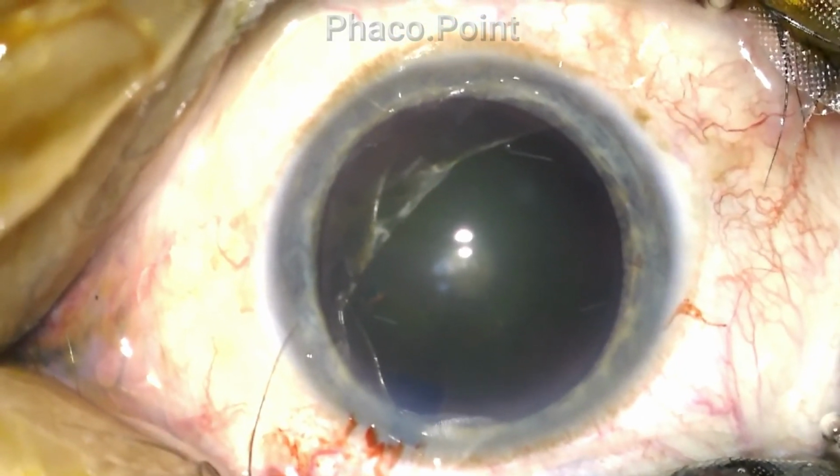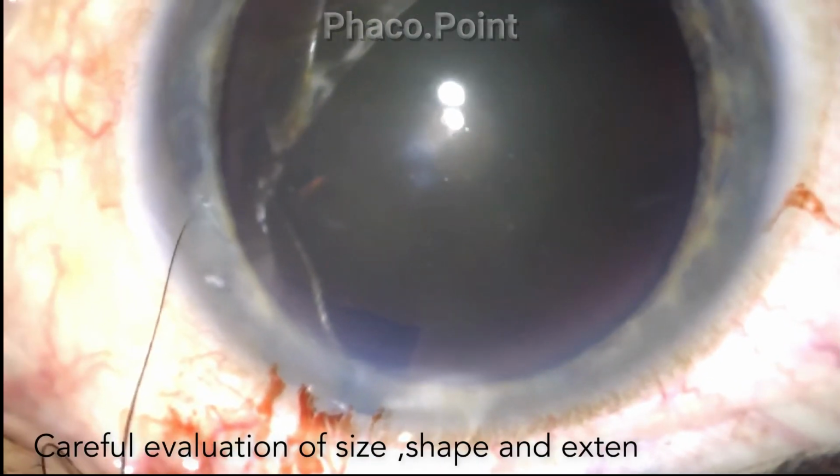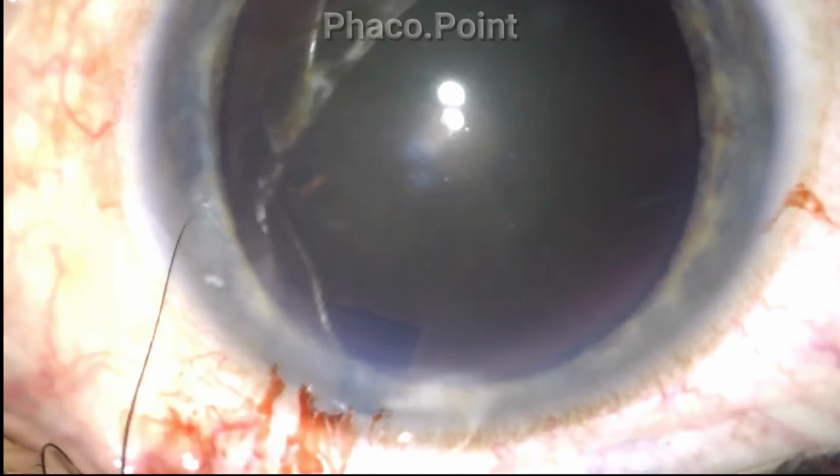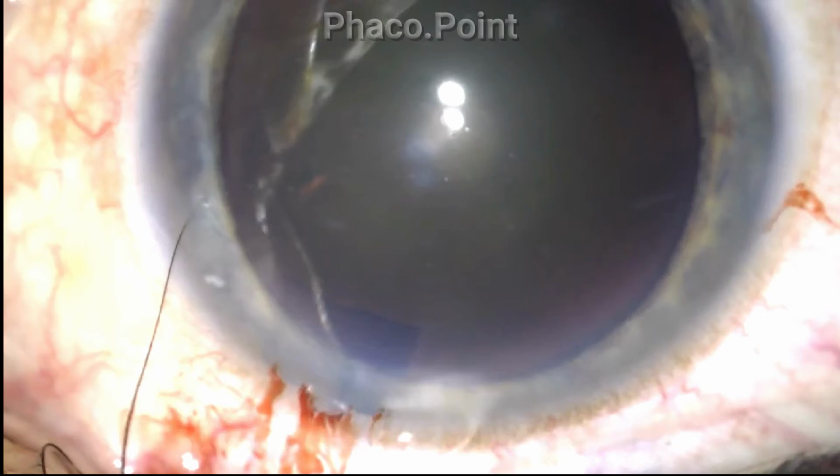It's extremely important to visualize under high magnification the exact dimensions, the location and the extent of the tear. It's also important to rule out the presence of any other associated damage, be it to the sphincter or to the zonules or the corneal endothelium, which may coexist.